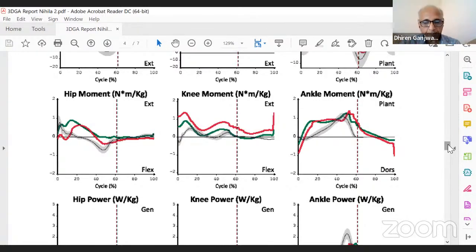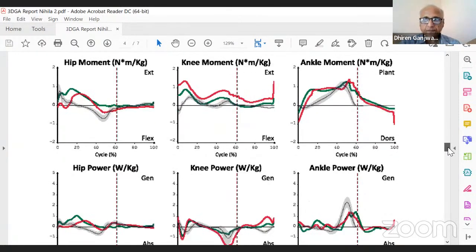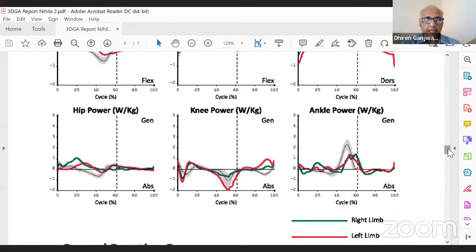So what is your impression from this? Let me first of all show you the ankle powers, the kinetics. Yeah. So she actually, as we said, is really quite functional. Looking at this qualitatively, she's able to generate fairly good propulsion with her ankle power and fairly good with her hip power. So I think she has the potential for normalizing a lot more of her gait function by us trying to take care of some of these impairments.